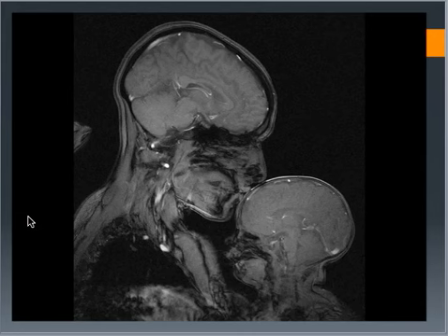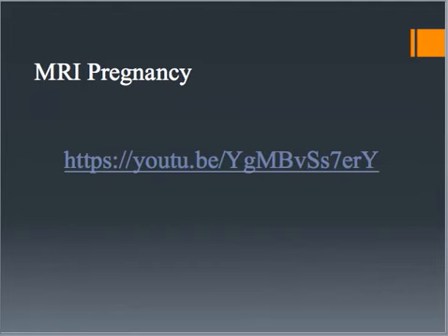And this is just another still image taken of mother and baby. There are some scans that float around the internet that say they can show love in the brain. I did a little research on it and I couldn't find any validity in the actual image, but this image itself is real. A lot of times if they're trying to scan the baby, the mom or parent will stay right in there with them. And I believe with this one, the MRI tech just saw the opportunity with the mother kind of kissing the baby and thought it would be a neat image. But I do have an MRI of a baby in the womb and moving around.